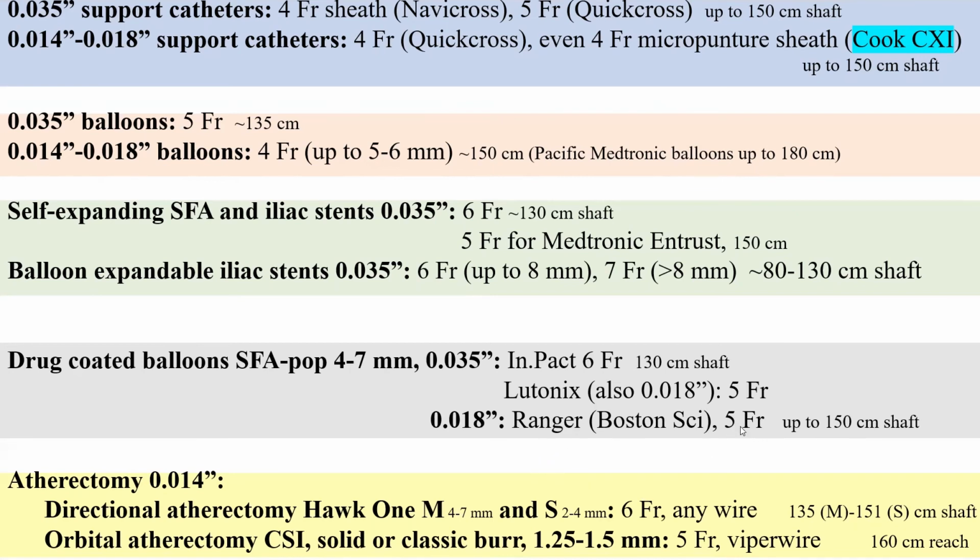And it has a longer shaft in cases. It can come handy in short patient if you're doing radial access, but even 150 is not enough in radial access, except if somebody is very short, meaning, you know, about less than 155 centimeter in height.